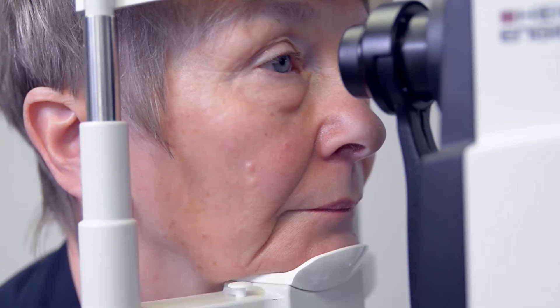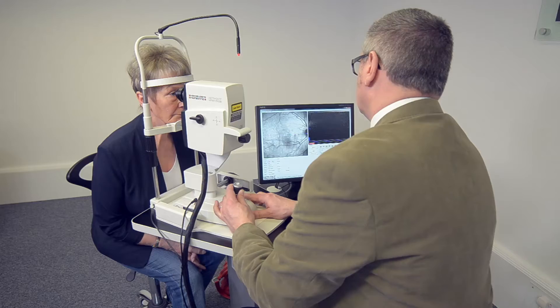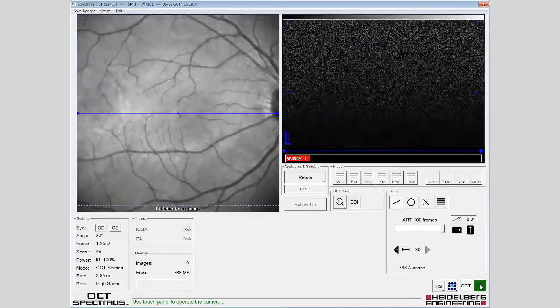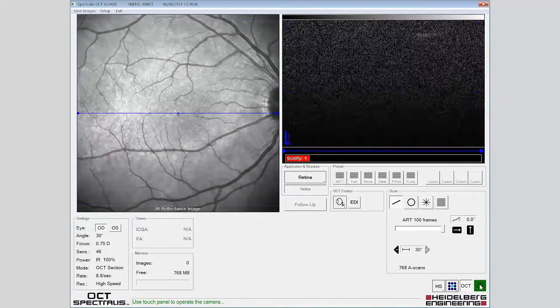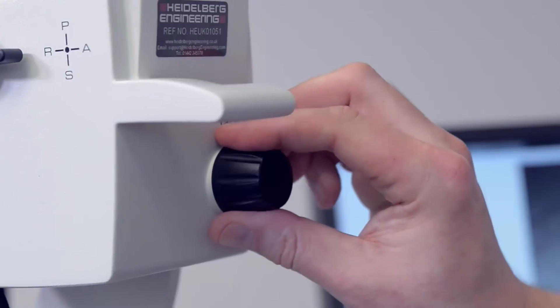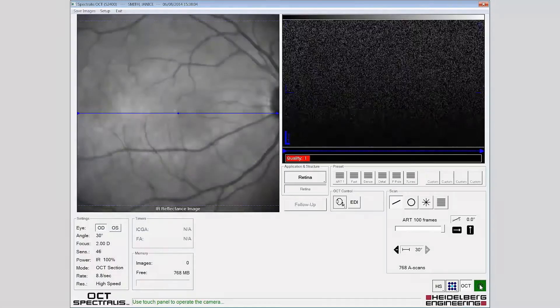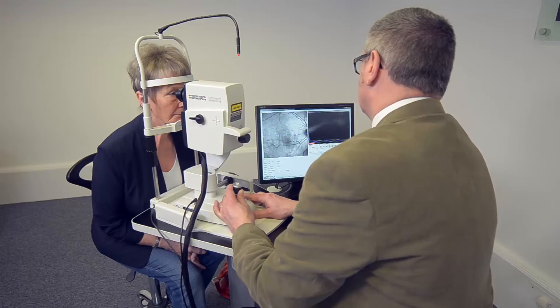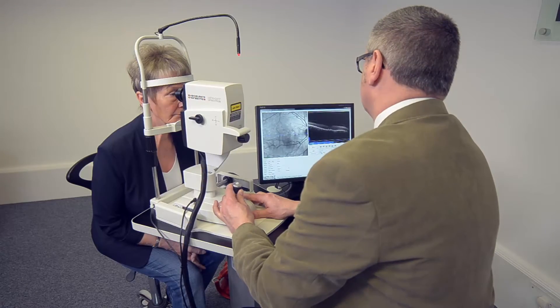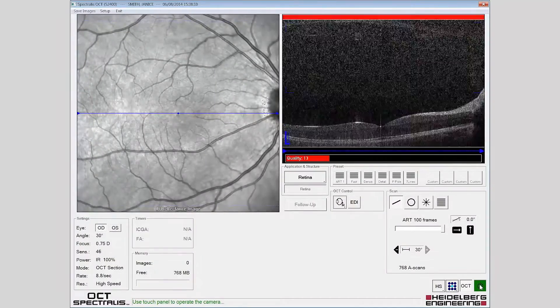The patient should be encouraged to blink during the examination. The fundus image should be checked for sharp focus and adjusted accordingly. The instrument should then be moved forward to visualise the OCT image and positioned in the sweet spot indicated by the blue brackets.